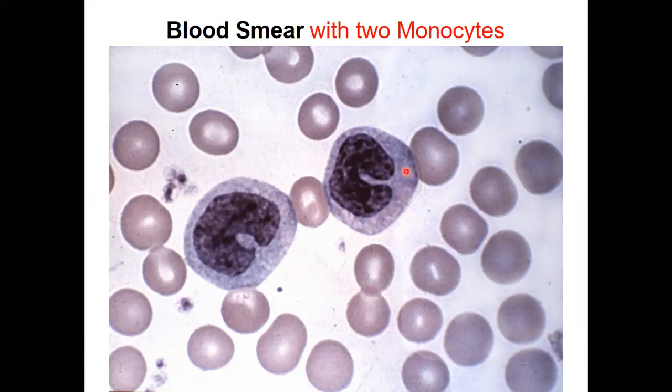As we can see here, the cytoplasm is stained basophilically like that, but the nucleus is very clear. So books will say kidney-shaped or bean-shaped nucleus. So the nucleus is not cut in half to give us 2 lobes or 3 lobes. It's only an indentation here, then it has this shape. So this is a monocyte.